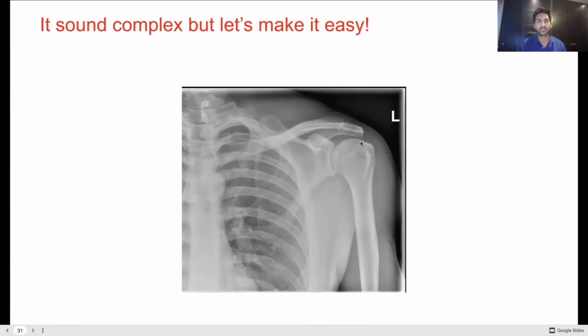And you have the humeral head sitting over here. That's the humerus. And you've got your humeral neck, and you've got your humeral shaft. And therefore, this must be the glenohumeral joint, because this over here is the glenoid. Your acromioclavicular junction is sitting over here. And then over here, you've got your scapula that's going all the way like so.